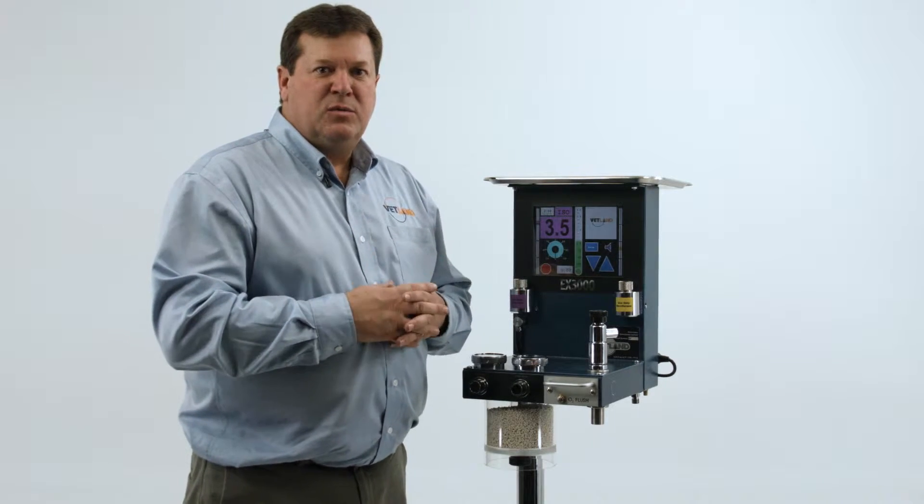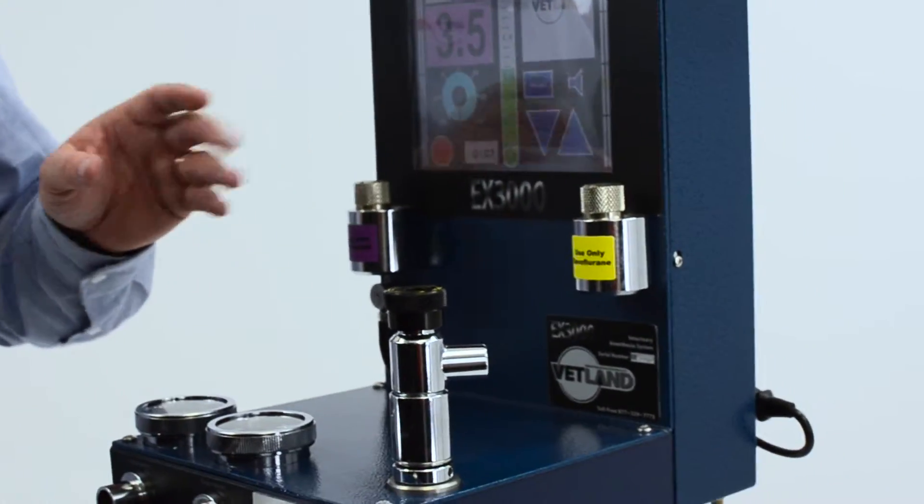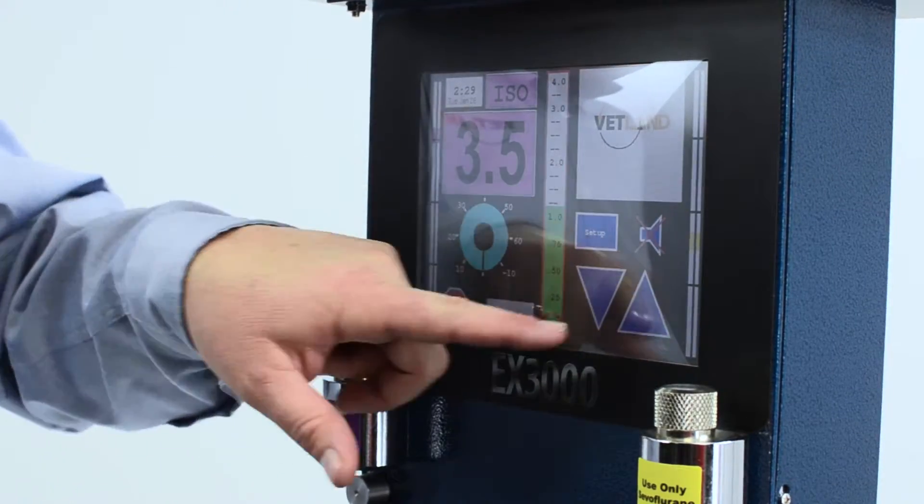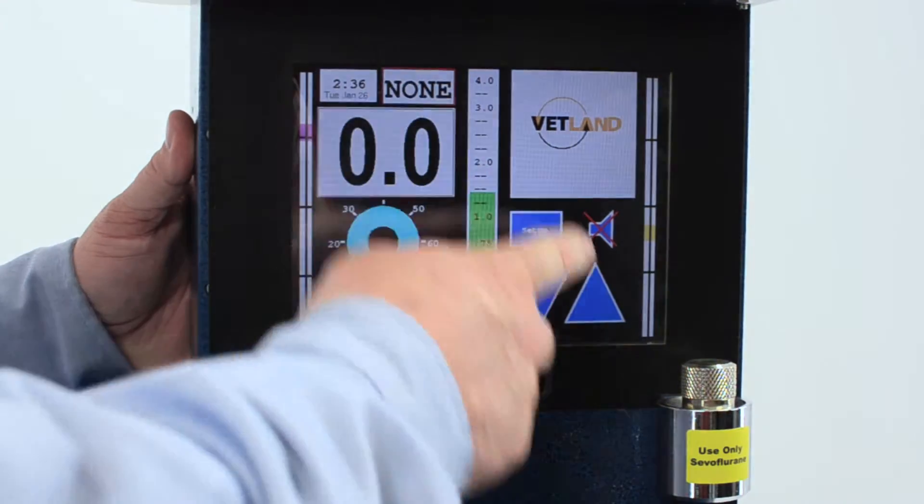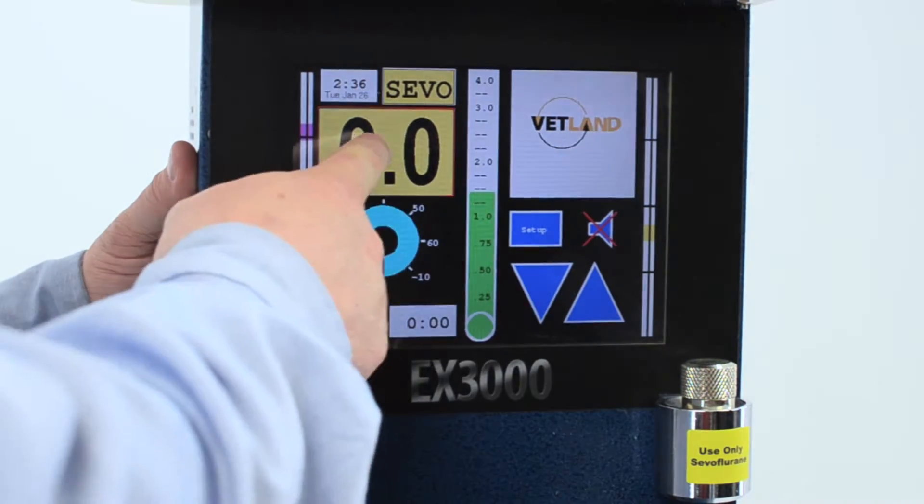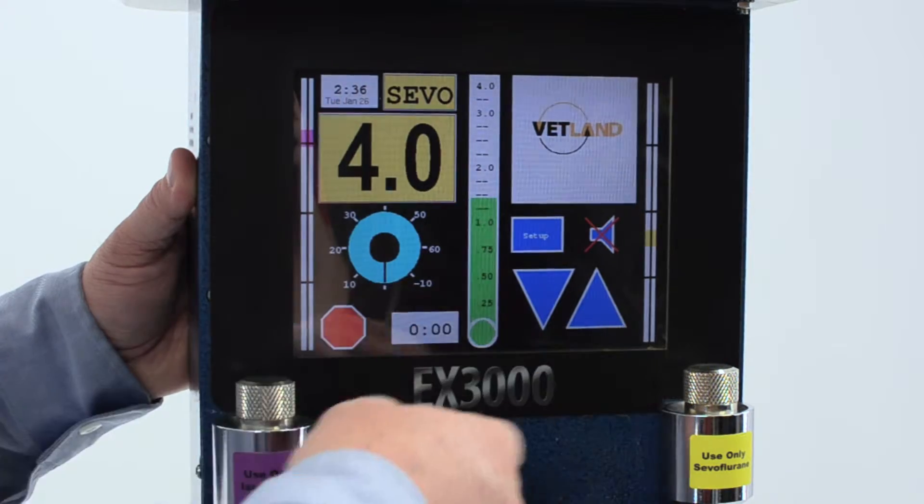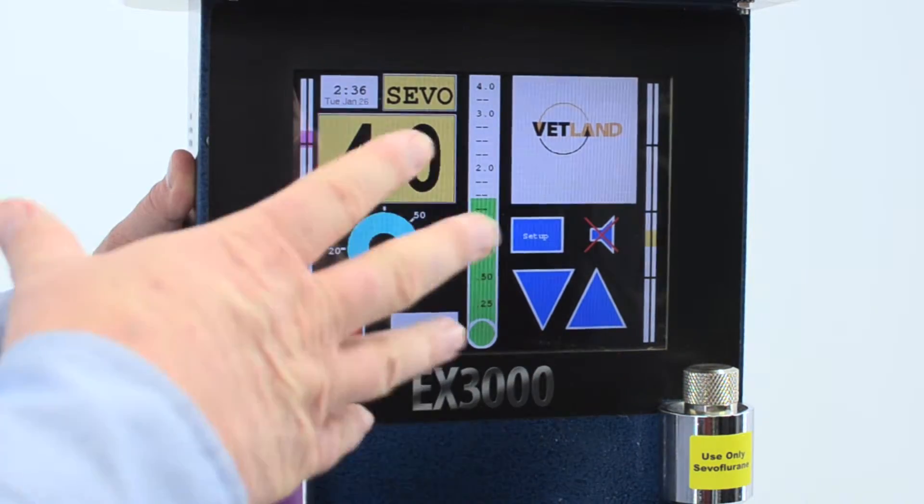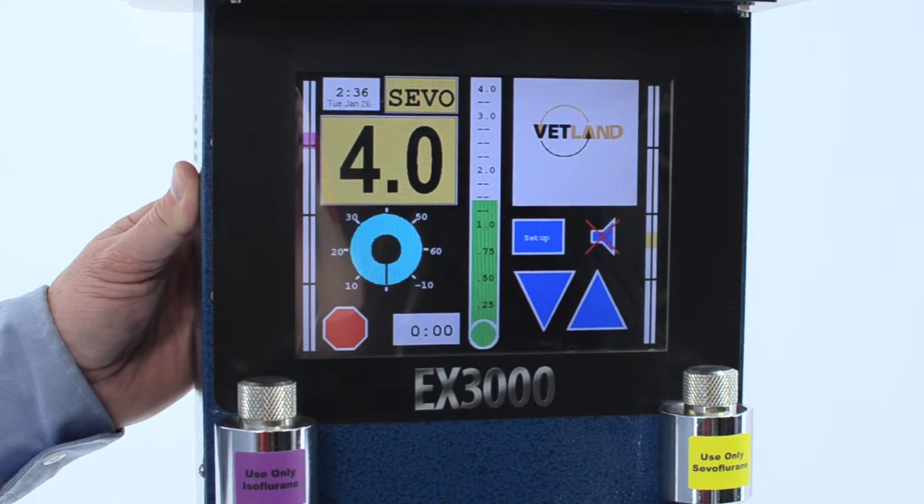The EX3000 is a color touch screen. If we want to increase the flows from one liter here to two, we just dial it up and it locks in. Then you can choose either isofluorane or sevofluorane, and then you touch this box and arrow up or arrow down to whatever percentages that you'd like to deliver. The system locks in and now it's delivering this mixture of oxygen and anesthetic drug.